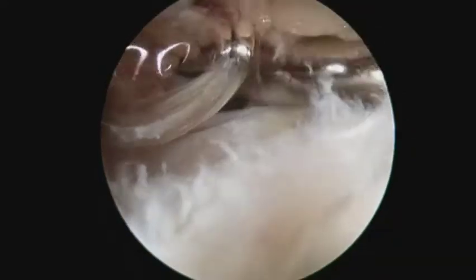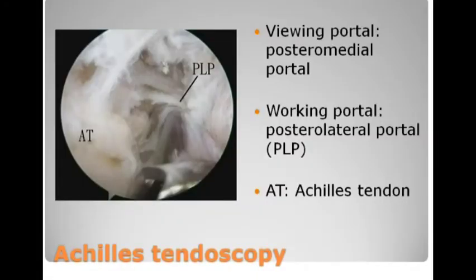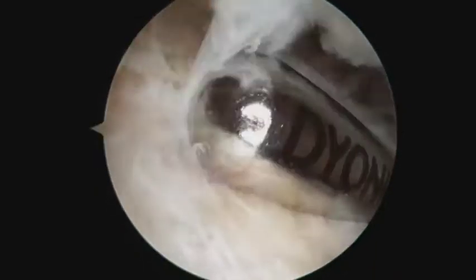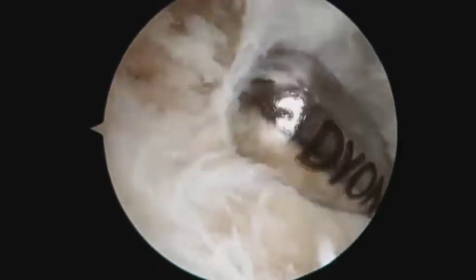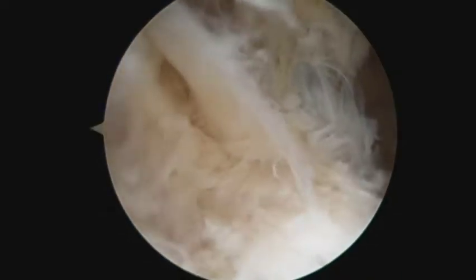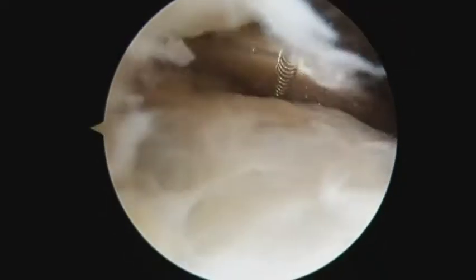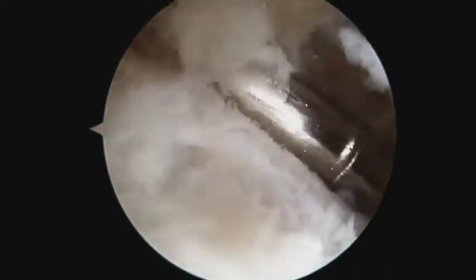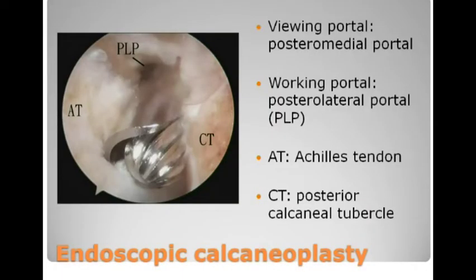The ventral surface of the Achilles tendon is debrided to remove all the fibrous adhesions and neovascularization. After completion of the debridement of the Achilles tendon, endoscopic calcaneoplasty is performed through the two portals.